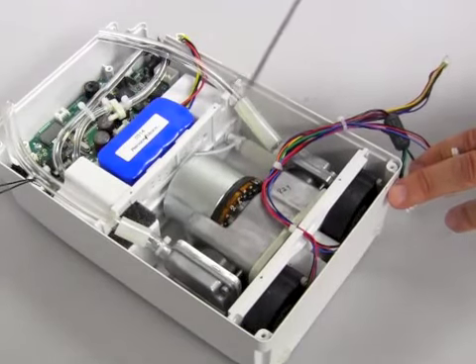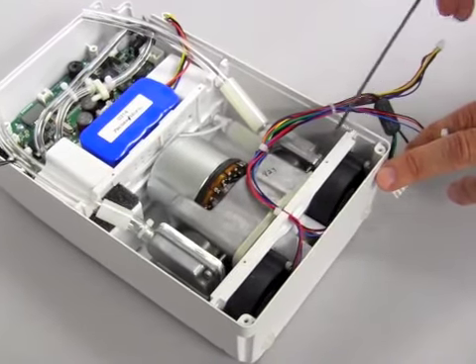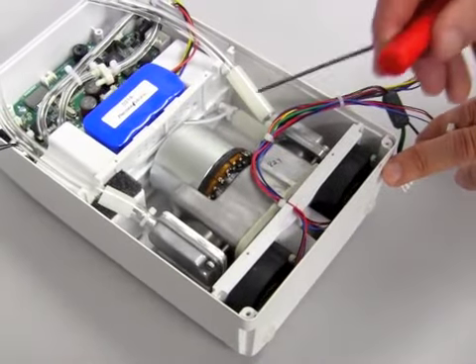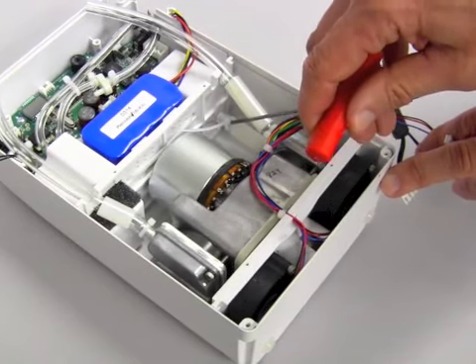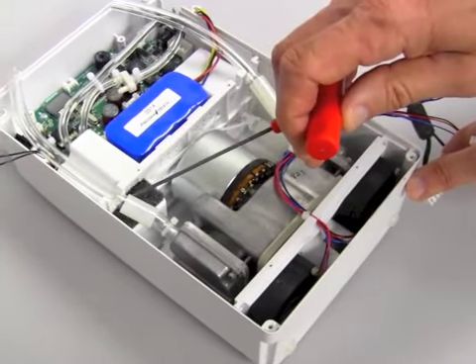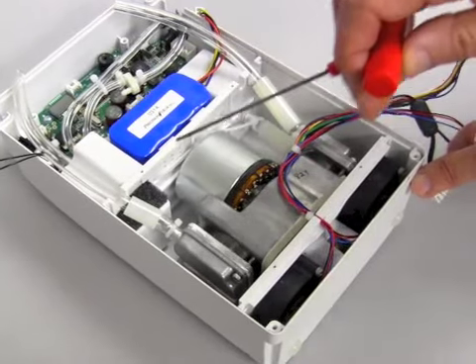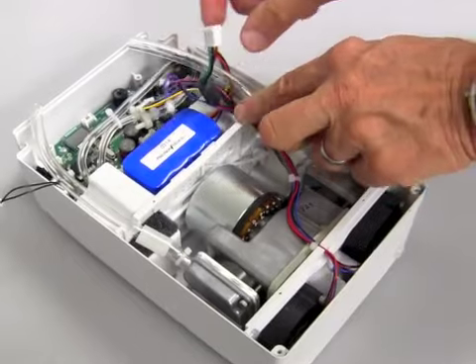Okay, this shows that the compressor is back installed in the case. You can see that the fan assembly is back in the grooves on the case. You also can see that the tubing is inserted on the nipple. I have not pulled the wire tie shut or tight yet, but it's ready to be tightened. And also it shows that the tubing from the compressors are in their proper slots on both sides. And the last thing you want to do is push this wire bundle back in place.